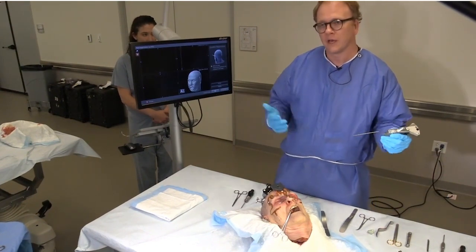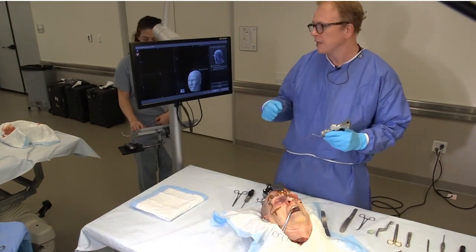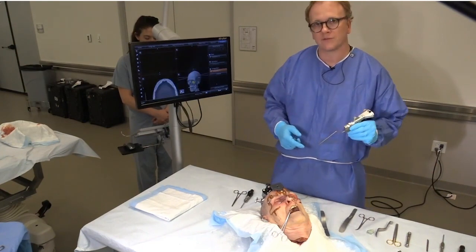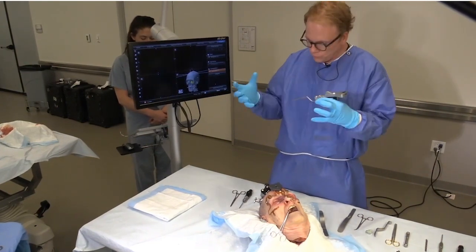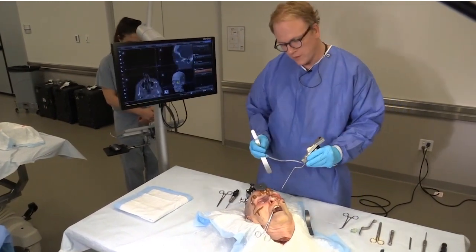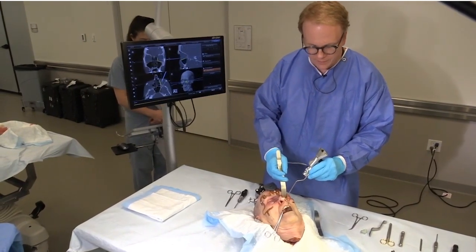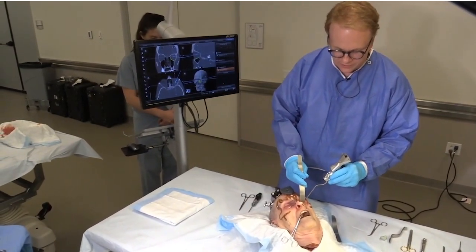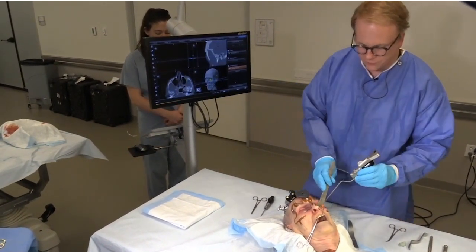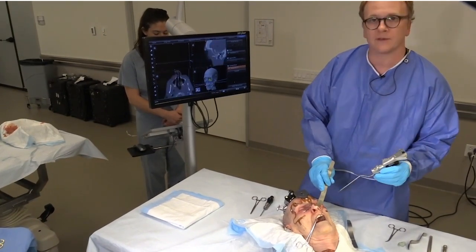If you're happy with your registration, you're okay to proceed with your operation. If not, you have options to refine the matching — you can choose bony points, soft tissue points, or trace around soft tissue to gather more data to improve the data match between the patient and the CT scan. In this case, we're going to begin exploring a fracture. This patient has an orbital floor and medial wall fracture which I created prior to this.